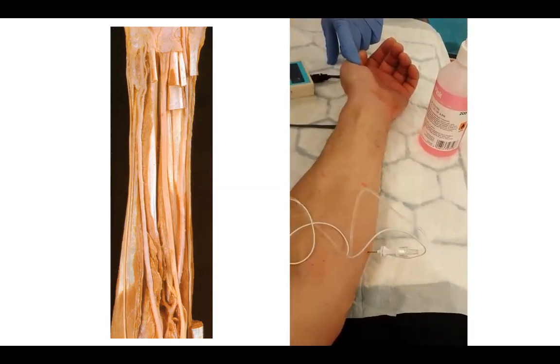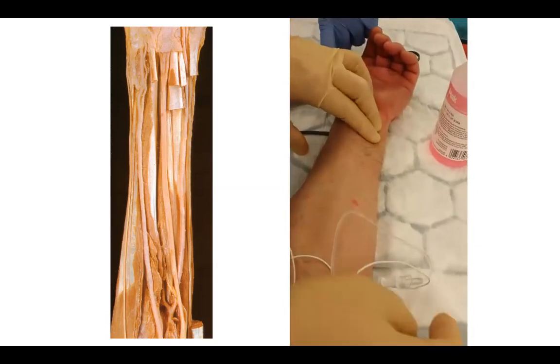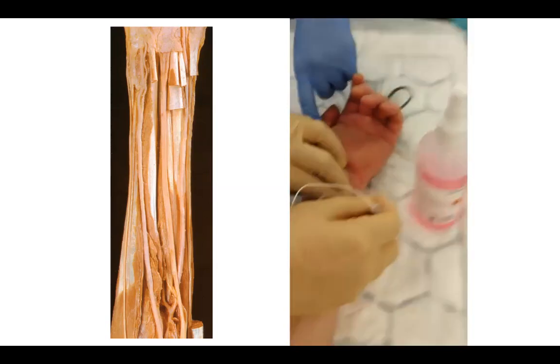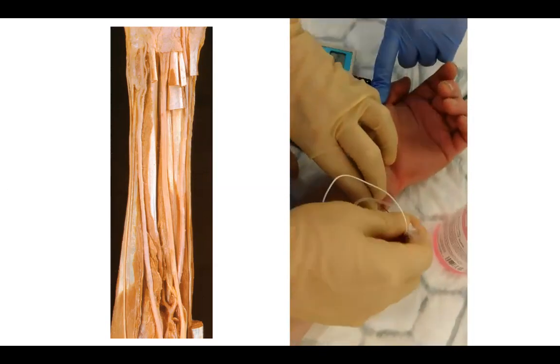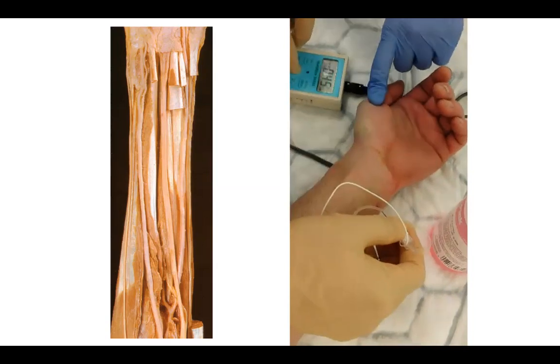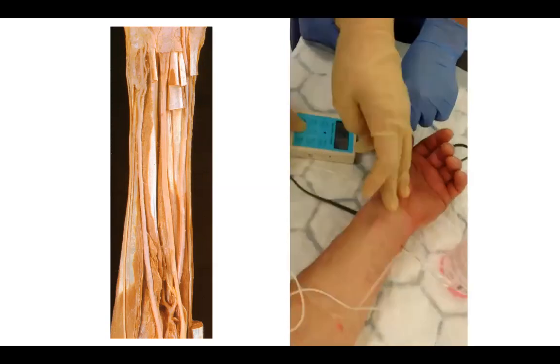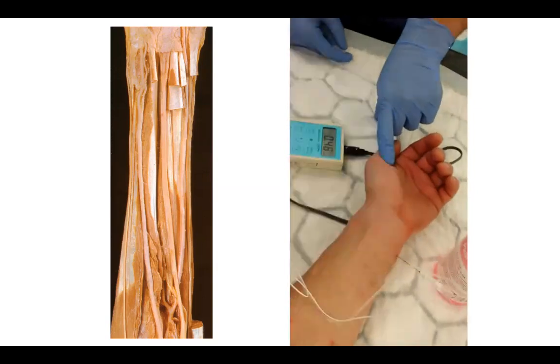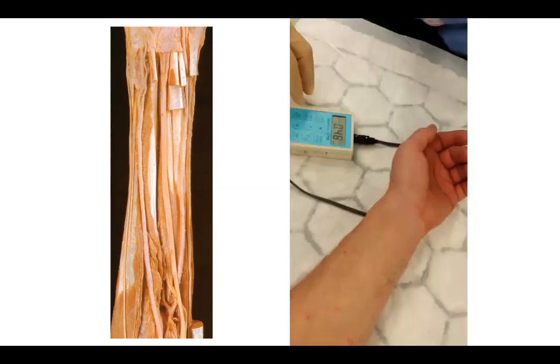The nerve is about three centimeters deep at that level using a 50 mm needle. For the proximal approach, feel for the artery and go medial to it. At this level the nerve is quite superficial and you get a response almost straight away. Inject around 3–5 ml of 0.375% or 0.5% bupivacaine for these blocks.